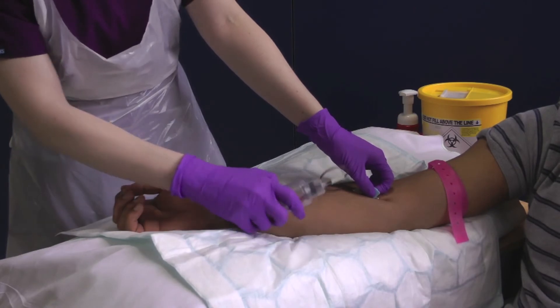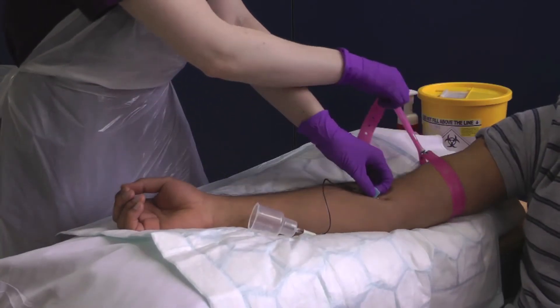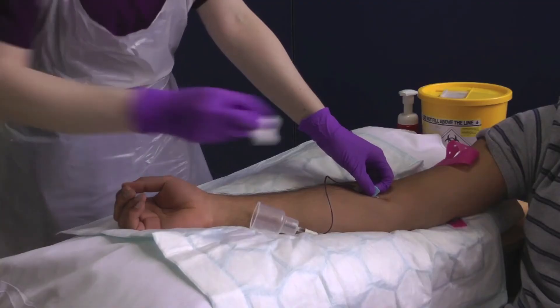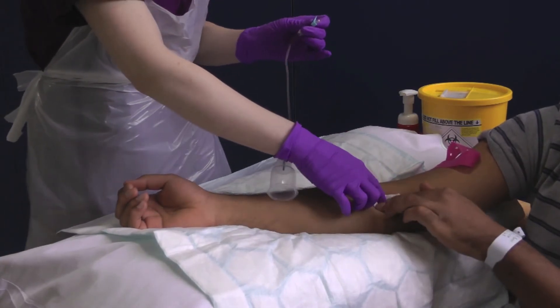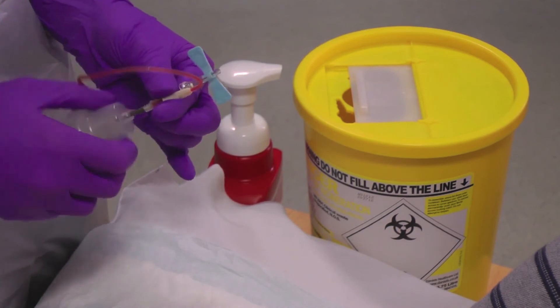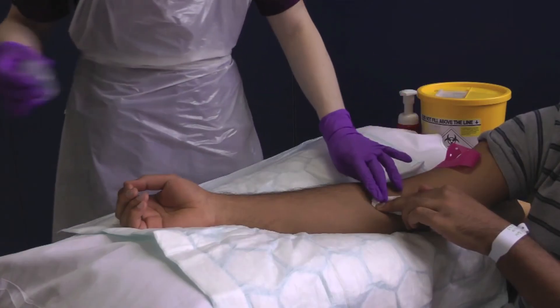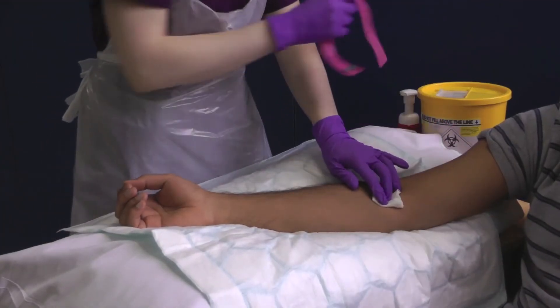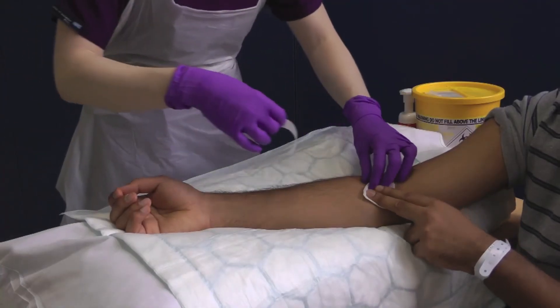Remove the anaerobic bottle and release the tourniquet. Without pressure, apply the sterile gauze to the puncture site. Withdraw the needle and pull the wings up to resheathe it. Unscrew the adaptor cap and put the needle immediately into the sharps bin. You can now apply pressure directly over the puncture site. Use a piece of tape to secure the dressing.